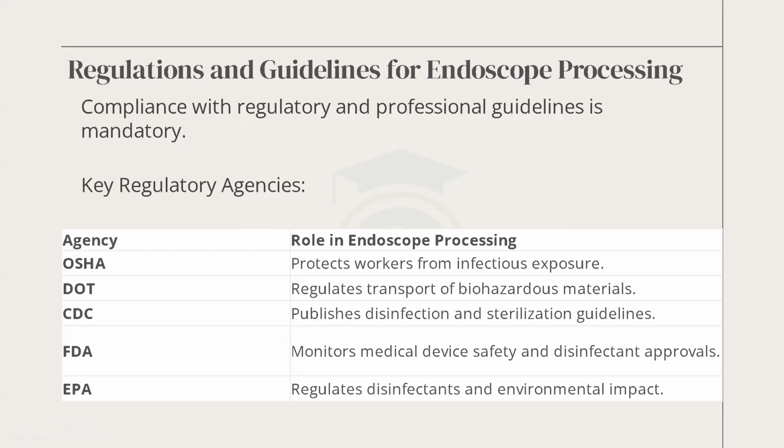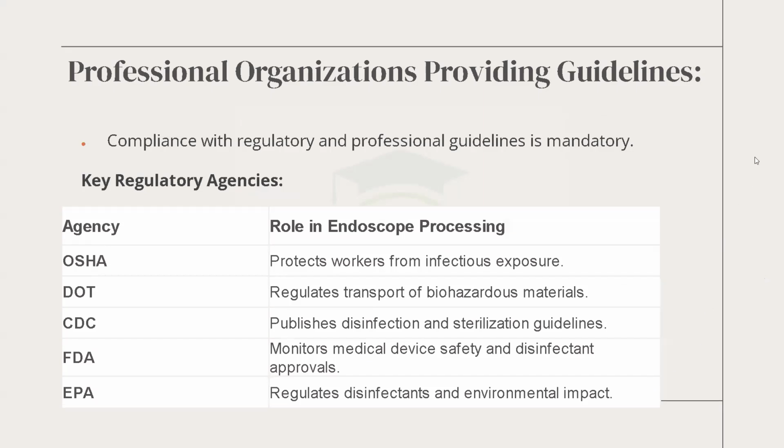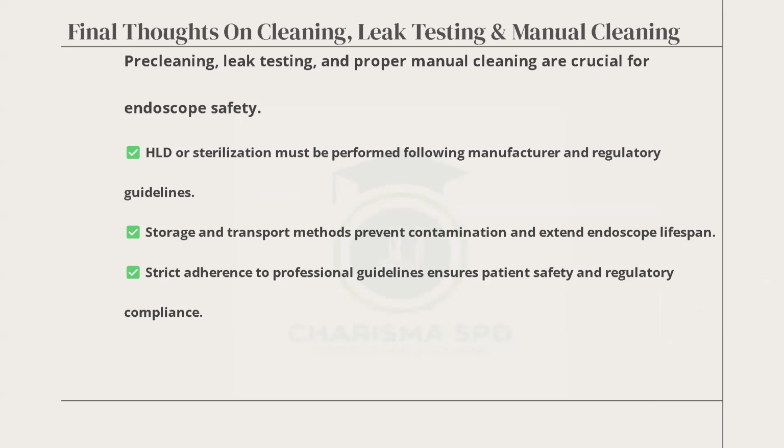FDA monitors medical device safety and disinfectant approvals. EPA, yes, when you use the chemical, it goes back into the environment. Is this safe for all of us, or are you killing us slowly? So they regulate disinfectants and environmental impact. Next slide. So basically, same thing, leak testing and what have you.